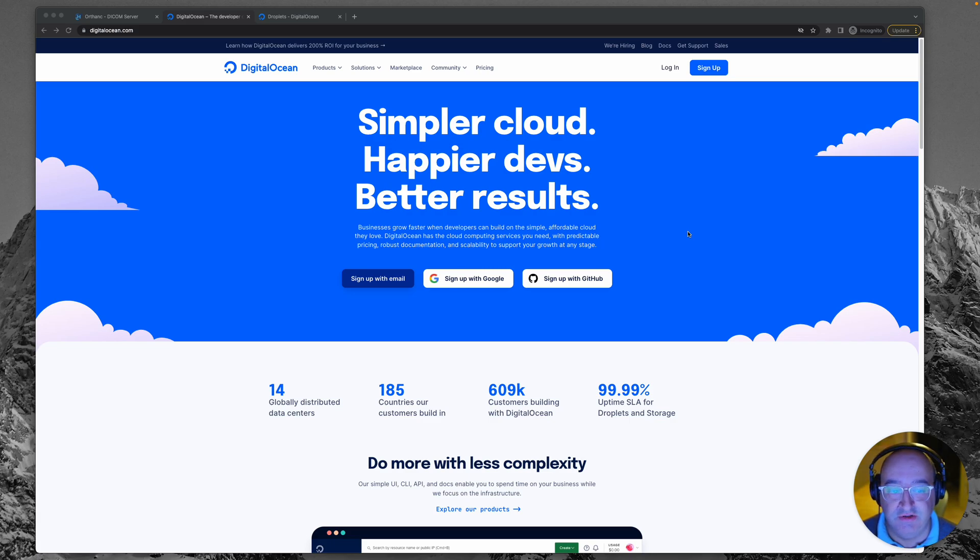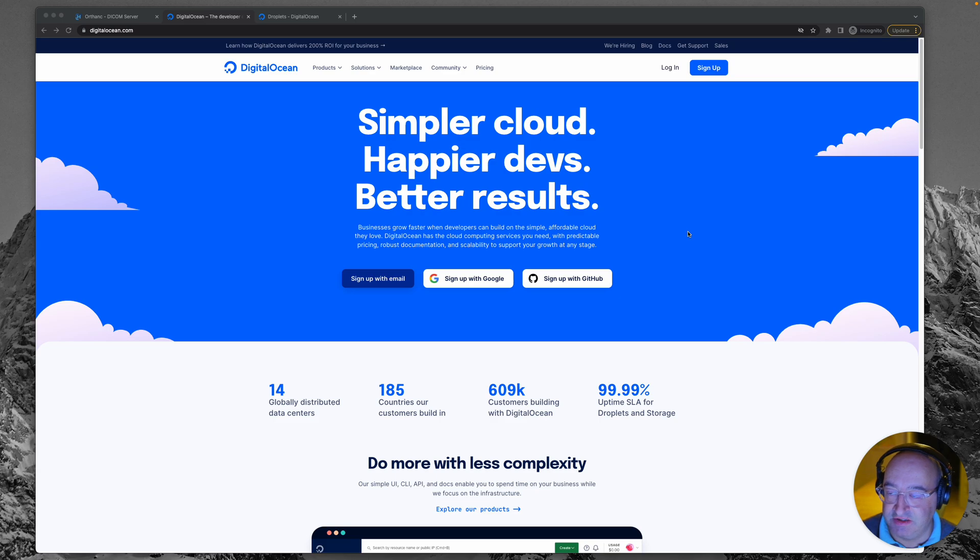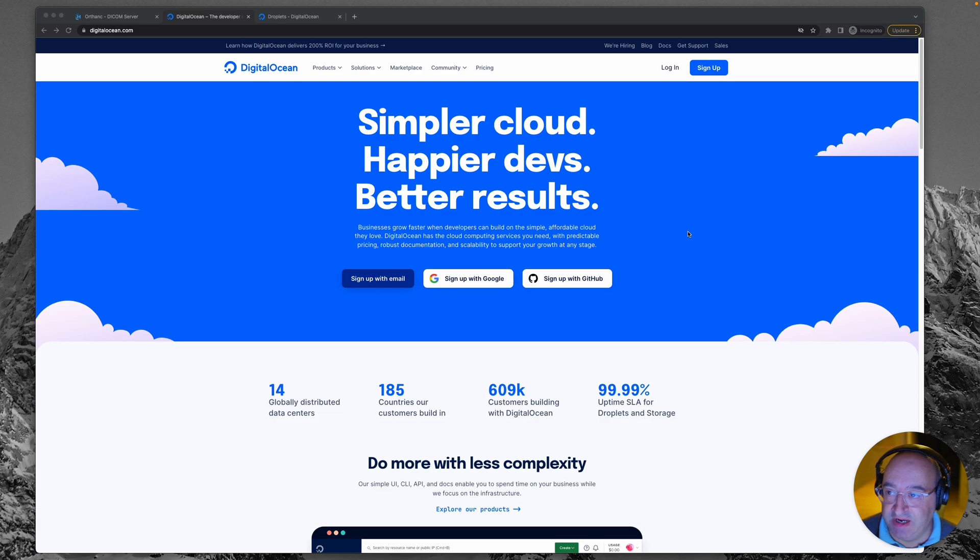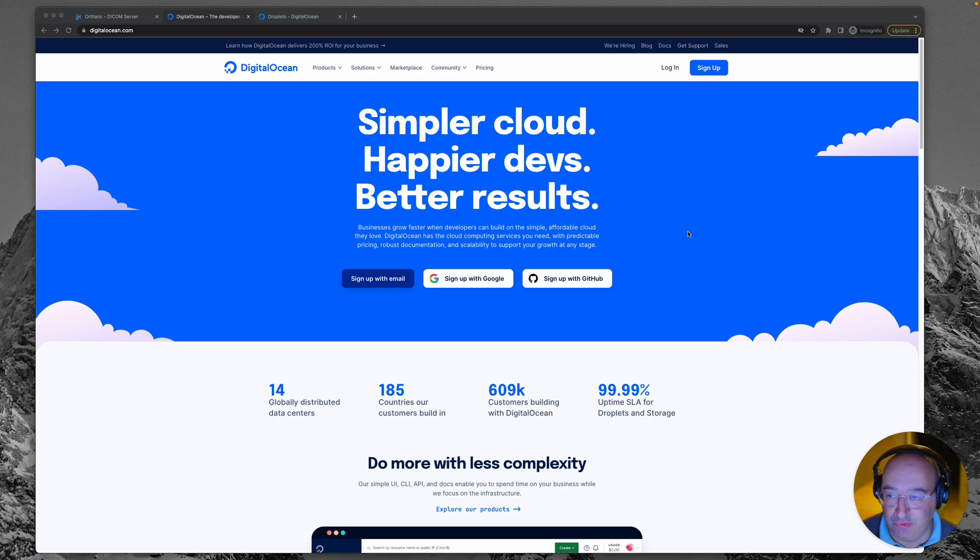Hey there and welcome to the second installment of our Installing Orthanc PACS server. Just to remind you, we're going to install our own personal PACS and this is done from the point of view of a radiologist rather than a software engineer.